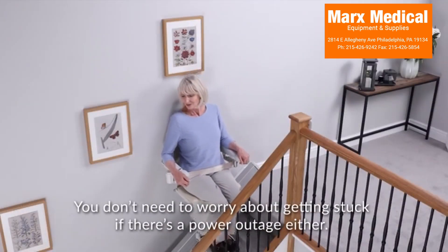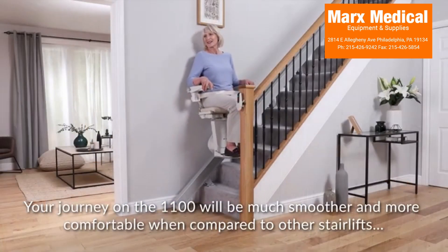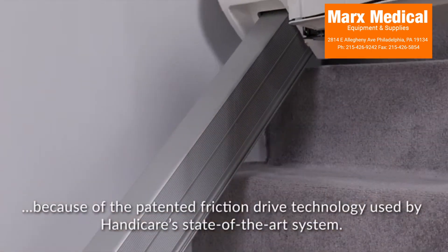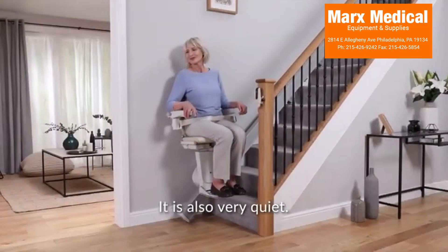You don't need to worry about getting stuck if there's a power outage either. Your journey on the 1100 will be much smoother and more comfortable when compared to other stair lifts, because of the patented friction drive technology used by Handicare's state-of-the-art system. It's also very quiet.